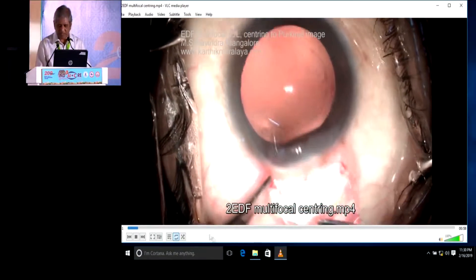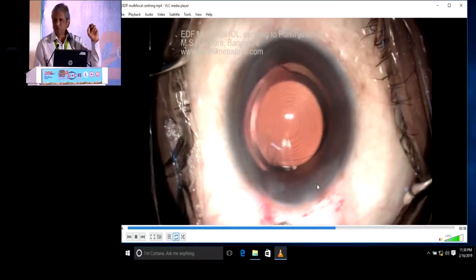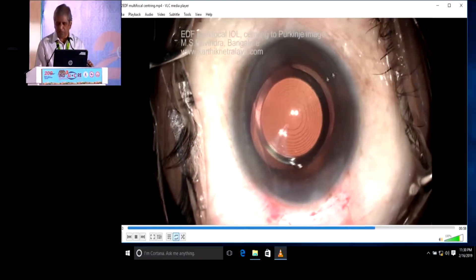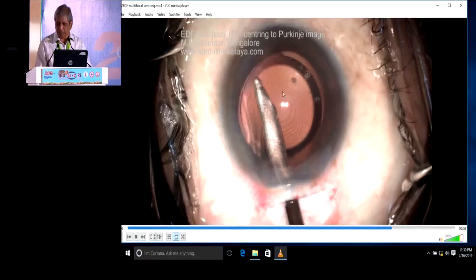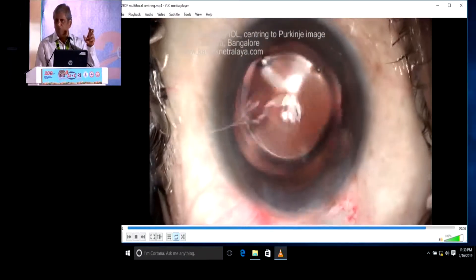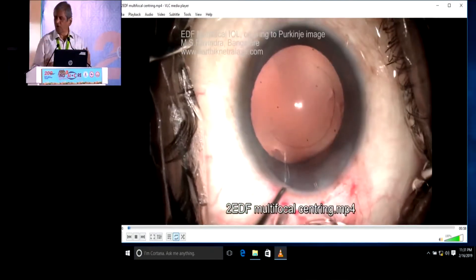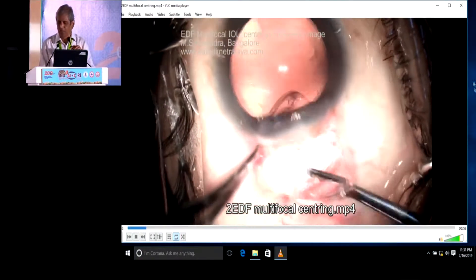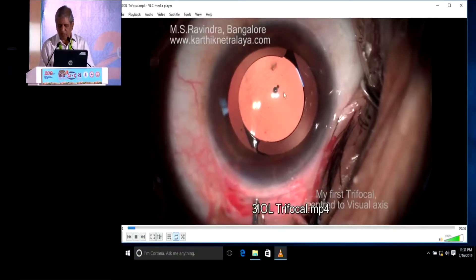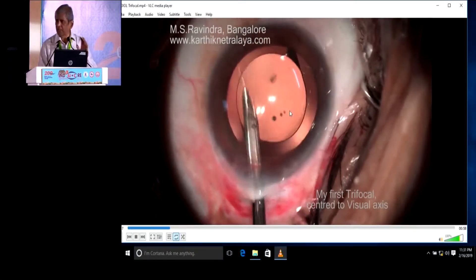Similarly, an EDF multifocal lens — let us just run through it. The biggest advantage I have is I do not have to squeeze it through a small tunnel. These lenses are made with such fine crafting, such fine equipment — these are 0.2, 0.3 micron things. If you keep them flat, the quality of the lens is going to be perfect. Imagine you want to fold it and squeeze it — it's like a nicely ironed shirt pushed through a small tube. You will not have lens-induced higher-order aberrations when you follow this technique. I enjoy doing trifocals. That's a trifocal lens with the beautiful rhexis placed inside, and they will have wonderful vision.